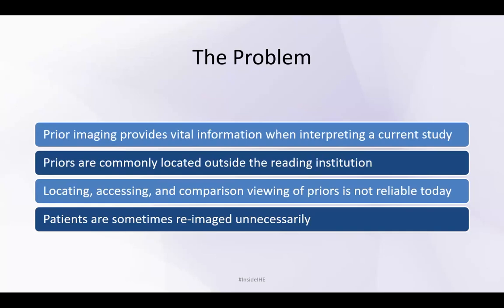The problem is that this is a slow process. Sometimes it may take 2 to 3 days before the images are uploaded, which delays the time the study is reported. And this is something that our referring clinicians don't like.